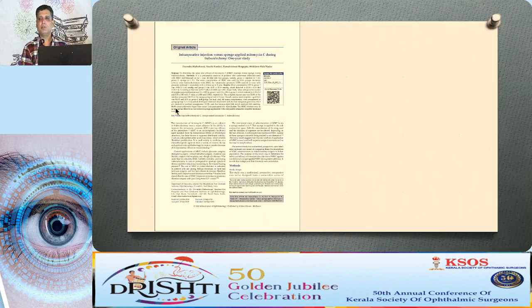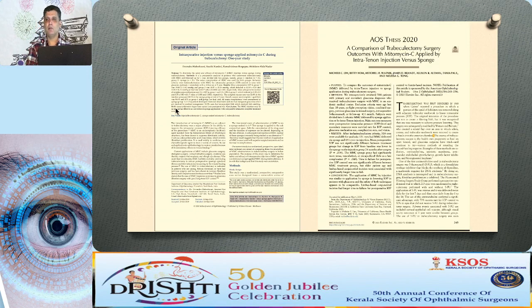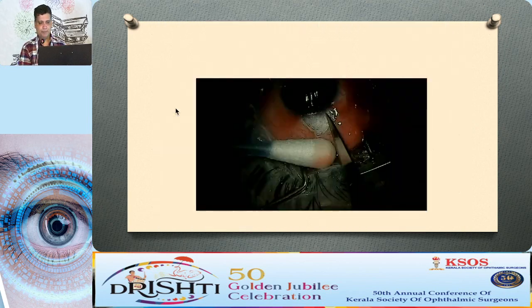Also, the other option is to use an injectable mitomycin, where you inject 20 microgram subconjunctively. Publications from both India as well as from the US have shown that this is safe and effective, the same as that of mitomycin sponges, and possibly gives a more controlled dosage.